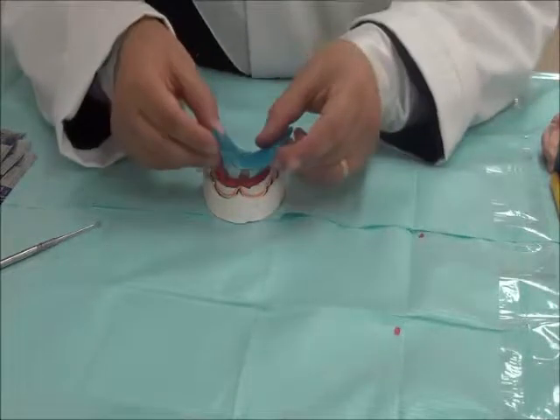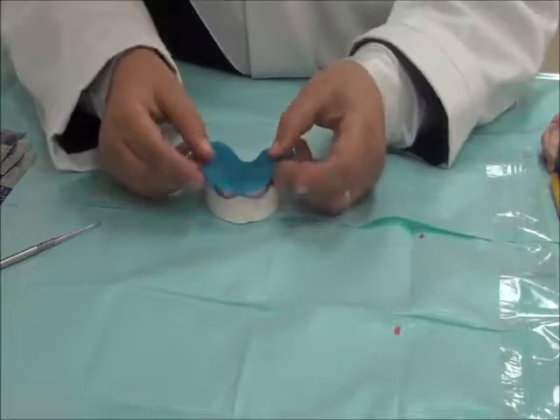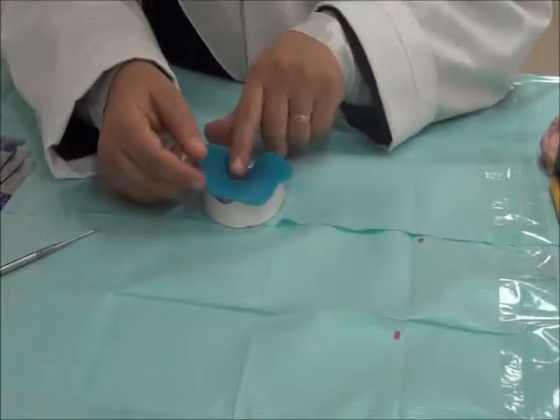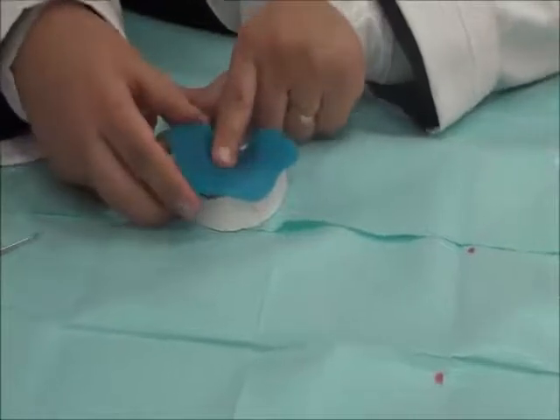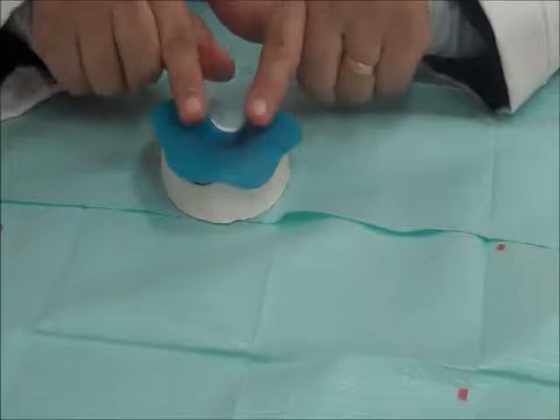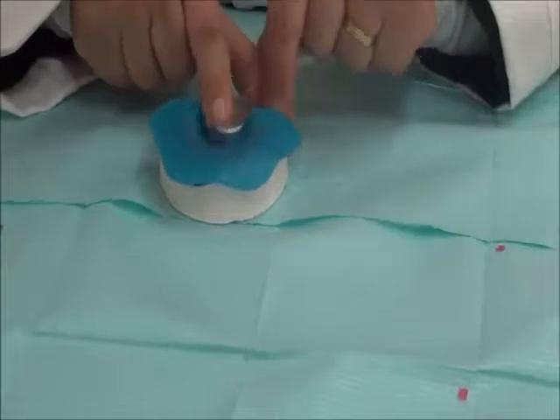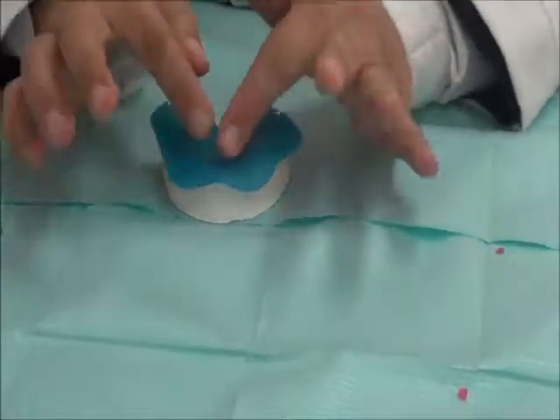So when we are going to do our steps, we concentrate that you once more adapt but do not press or thin the material. So we're going to adapt the material with our fingers from the palate first, then over the crest of the ridge. We're simply removing any voids or any air trapped inside, and then we run from the crest downwards.